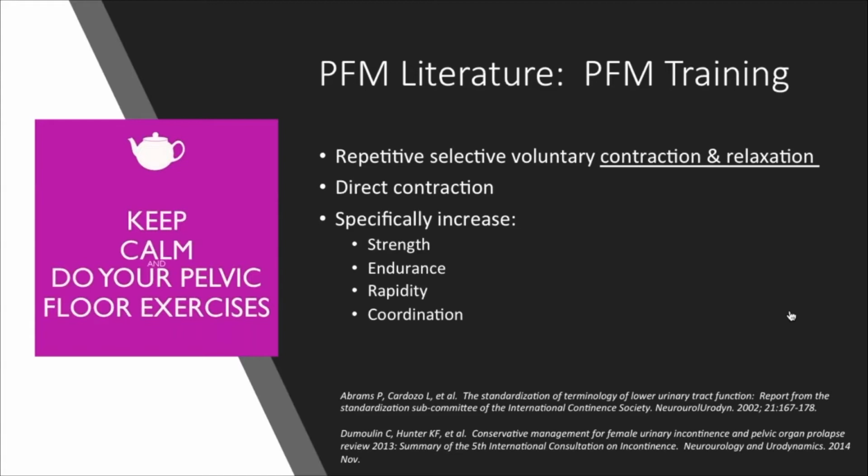And research recently, I would say more in the last 5 to 8 years, has looked a little bit more closely at the relaxation of the pelvic floor, and that's an area that ultrasound has been really helpful in coordinating with what our digital findings are with our objective examination, really getting a much better sense and being able to relay that information to patients so that they understand that it may not necessarily be all about the Kegel.